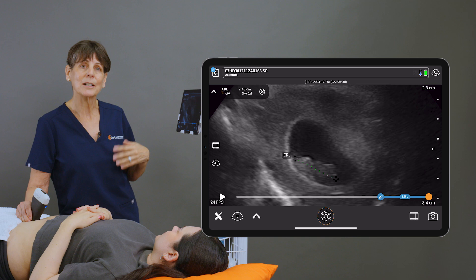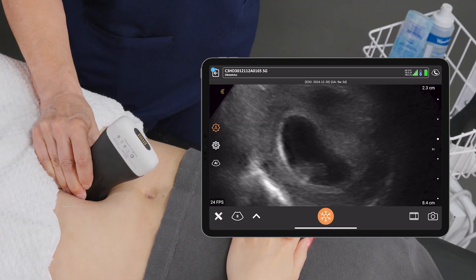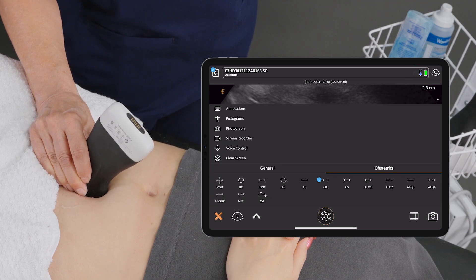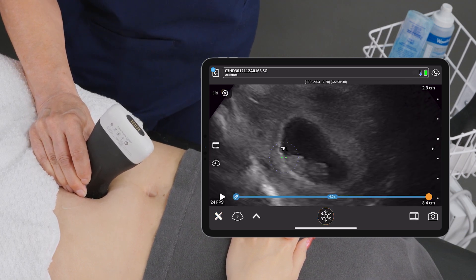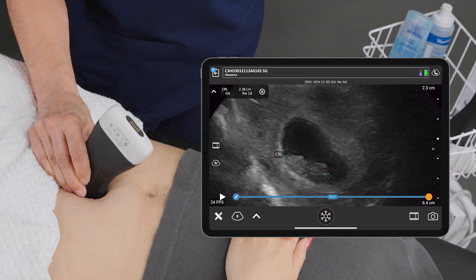We can take an image of that and it'll be stored in the report. We'll do one more and average the two. From the rump to the crown, I'm going to make a fine adjustment here and we're getting exactly the same measurement — almost 24 millimeters.